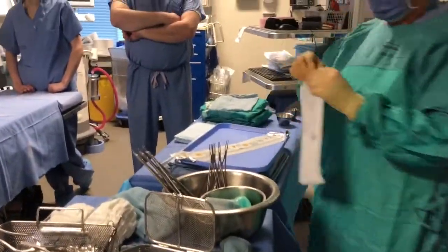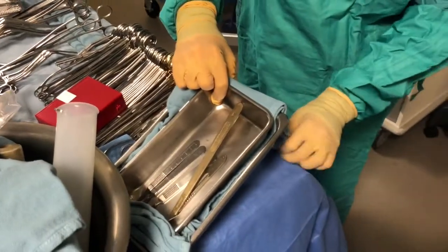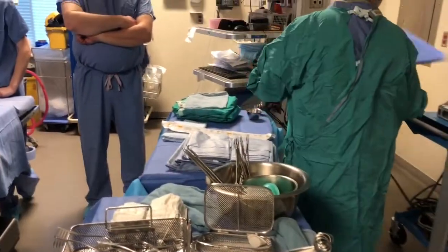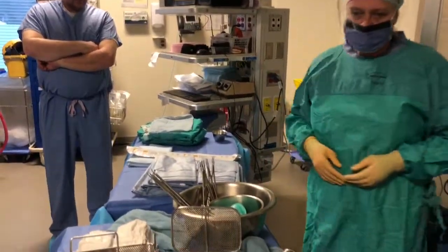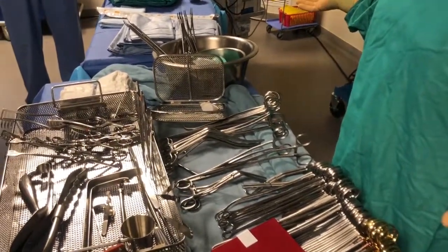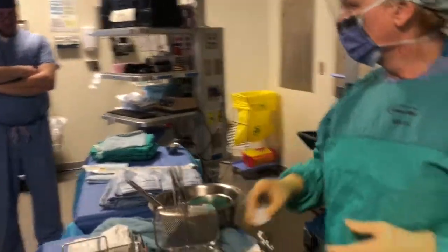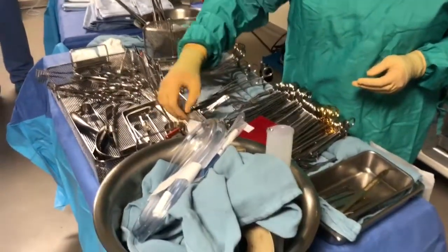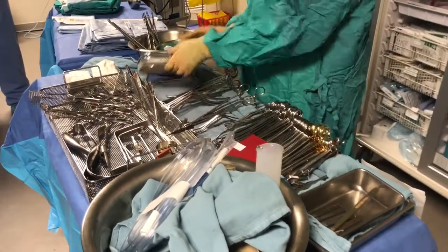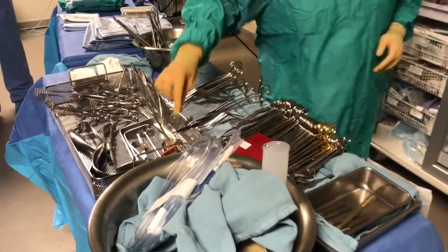I'm gonna need my sharp. Some people use these, I like them, so I put them here. My bag. And this is an ioband, and this can go. So basically, I'm set up for an aorta right now. Is there a little cup in there? This little cup.